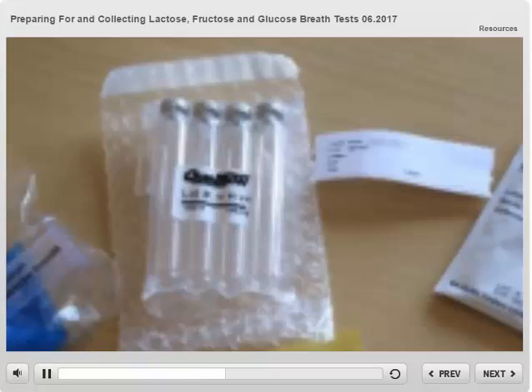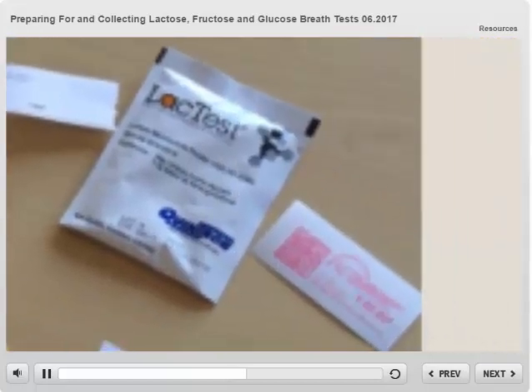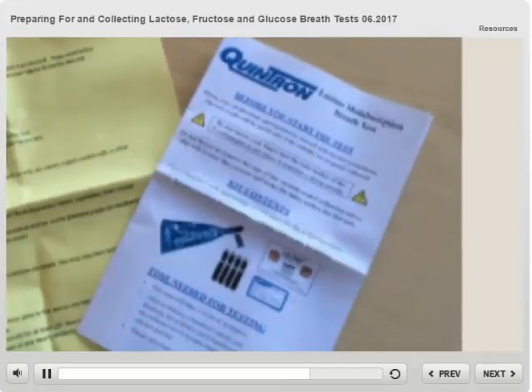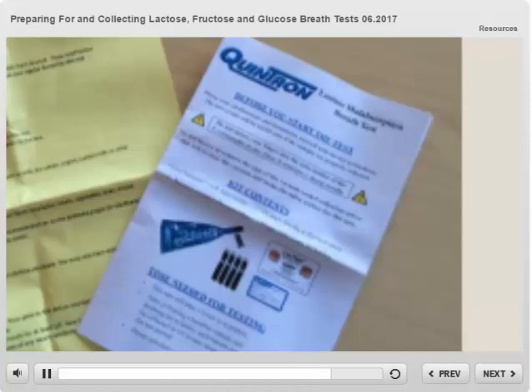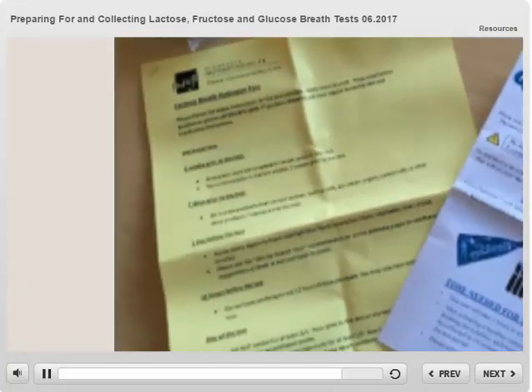You will have a label for each collection tube. Each kit also has a sugar packet — you will mix this with water to make your test solution on the day of the test. If you are mailing your test in, you will affix the postage to the outside of the box. There are also manufacturer directions that describe the test and collection process, and Minnesota Gastroenterology prep instructions and diary. You will document the time you collect each breath sample on this diary.